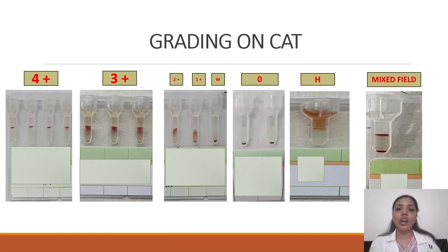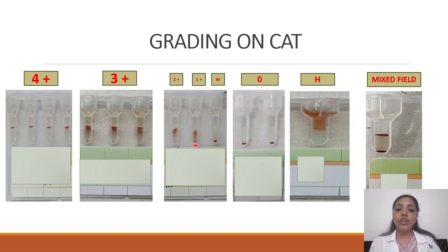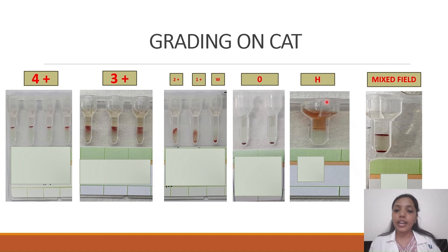Coming to grading of agglutination on the column agglutination technique: a solid band at the top of the gel card column is graded as 4+; agglutinated cells at the top with some suspension below is 3+; cells dispersed throughout the column is 2+; cells at the lower half is 1+; barely visible agglutination at the lower half is weak; no agglutination with all cells settled at the bottom is negative; a pinkish or reddish supernatant at the top indicates a hemolyzed sample; and two cell populations at the top and bottom indicates mixed field agglutination.